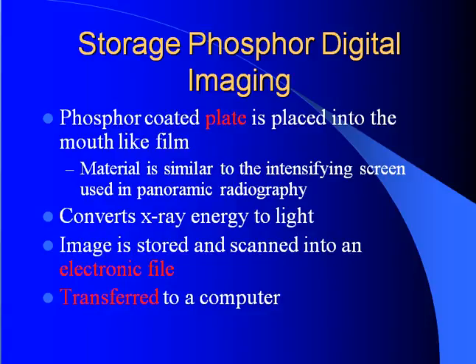However, instead of running film through chemicals, the plate is removed from the envelope and placed in the electronic processor, which digitizes the image and sends the information to the computer. The image is then erased from the plate, and the plate can be reused by being placed into another barrier envelope.